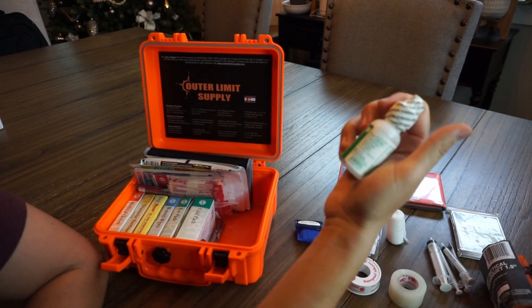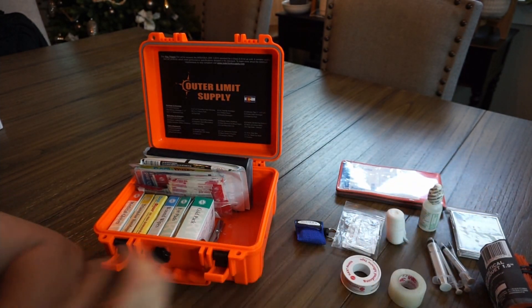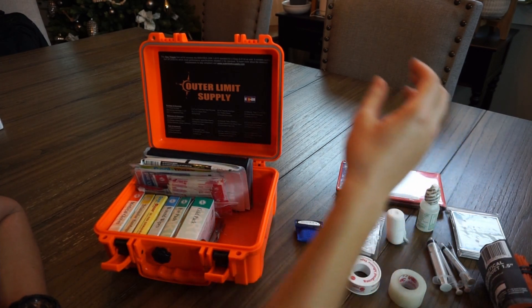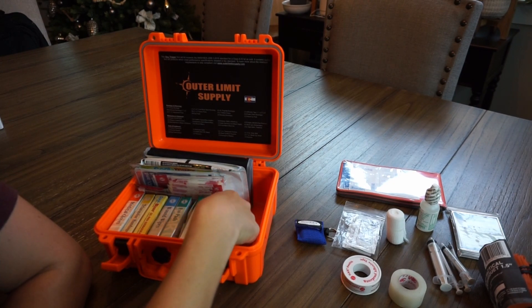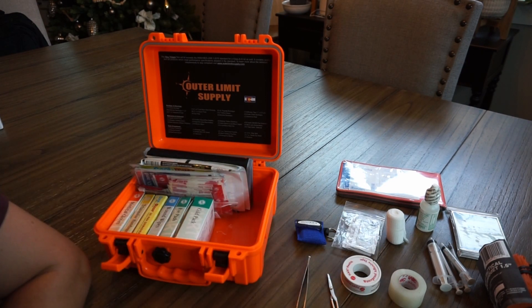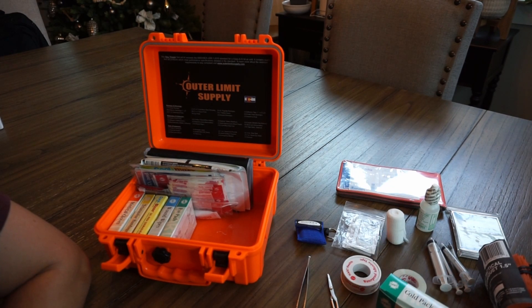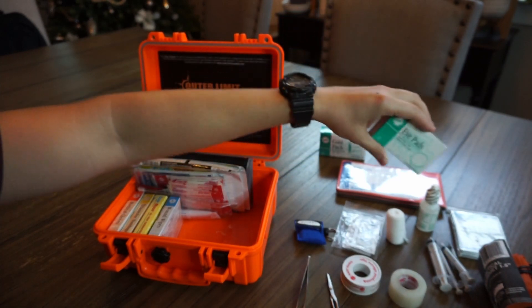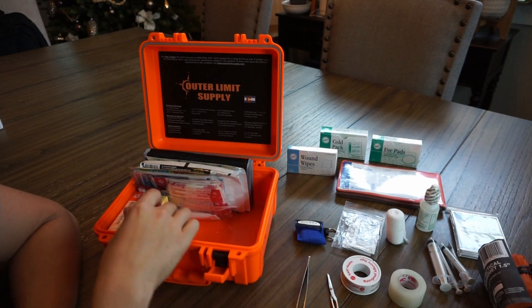This is an eye cleaning and eye irrigation solution for any sort of eye injury or if you get something stuck in your eye. It's not a huge amount but it's better than nothing. After that we've got metal tweezers and a metal set of scissors, a cold pack, and some wound wipes — just ten of them in there.